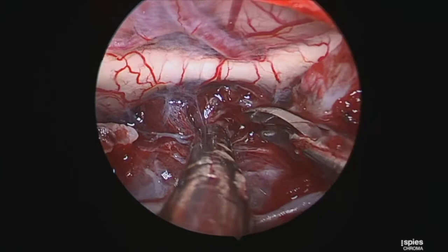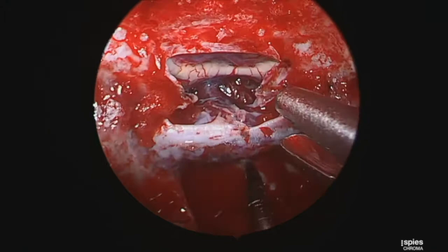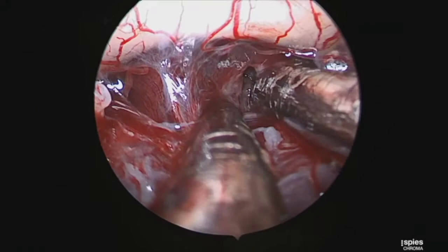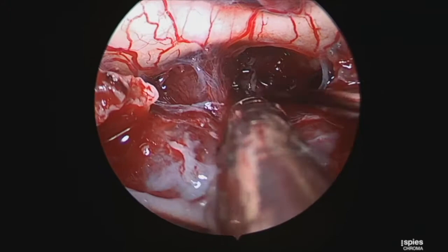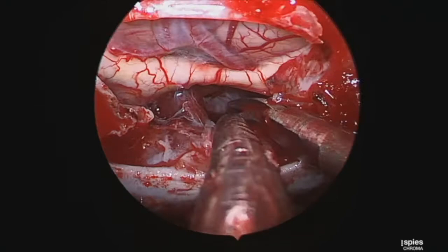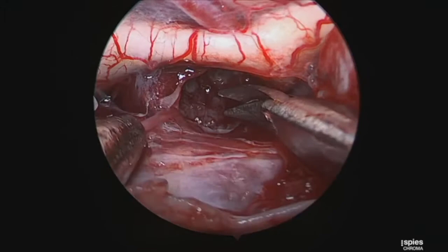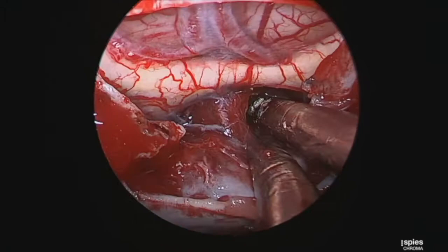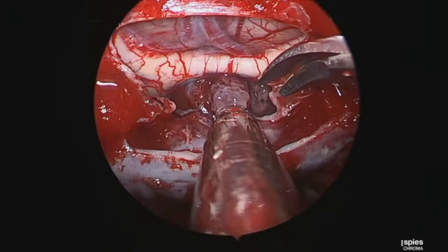Taking a look with indocyanine green, we can see some enhancement of the tumor. Here we can see the purplish tumor and its involvement of, but separability from, the subchiasmatic perforators. We then enter the tumor, navigating these infrachiasmatic perforators, and send a specimen to confirm the diagnosis of craniopharyngioma. This is a mostly solid tumor, so using two suctions we enter the capsule and gently suction it free. Once the tumor is debulked, microsurgical dissection using blunt and sharp technique is performed. We can see that the midline tissue, which was enhancing before, is intact pituitary stalk, pushed off toward the right side. Using rongeurs to send more specimen and two suctions, we carefully debulk the tumor in the window between the chiasm and the gland.